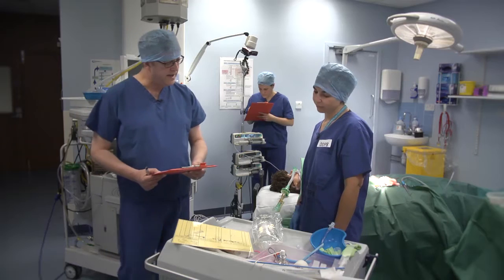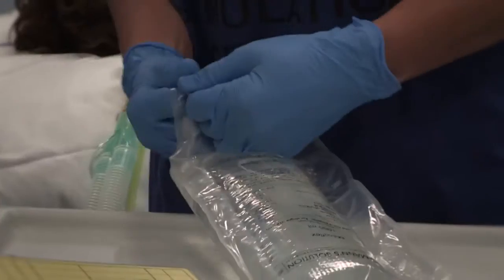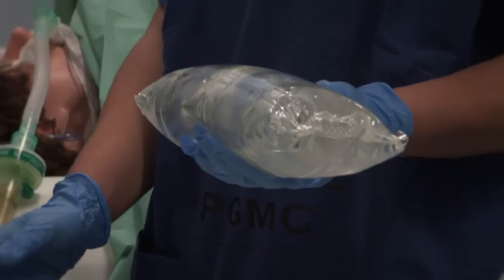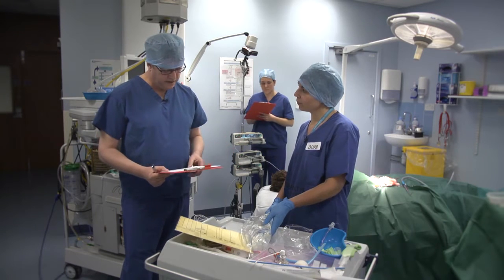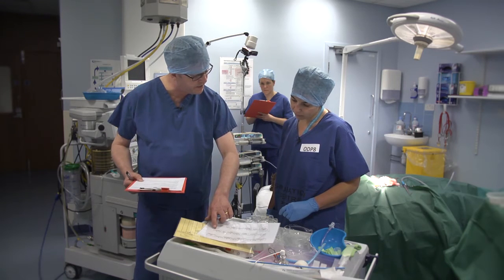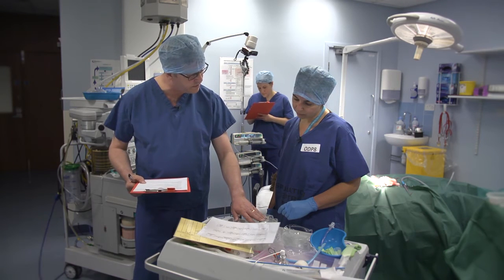They've requested Hartmann solution and this is Hartmann solution one litre. Could you please now open the bag? If I show you a scale where one means something's very difficult and seven means something's very easy, how difficult or easy was it for you to find the expiry date on the bag? Very easy — number seven.